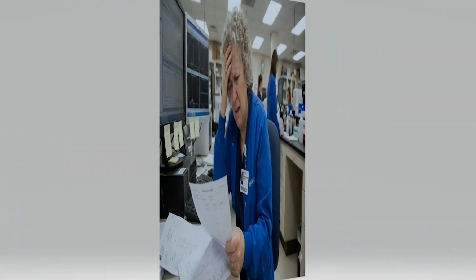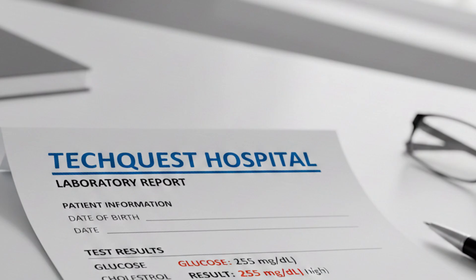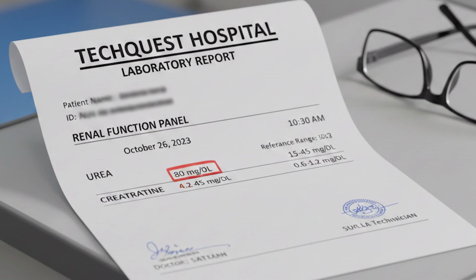Next check is the delta check. Some patients have previous test results that correlate with this report. For example, the patient's sugar reports are always high and this one is also high. We can report this result. Next, if we don't have the previous results and we are getting abnormal results, correlate with other lab results. For example, when haptoglobin level is low, look for LDH and hemoglobin results showing evidence of hemolytic anemia. When the patient's results correlate with other lab results, we can confidently release the results.